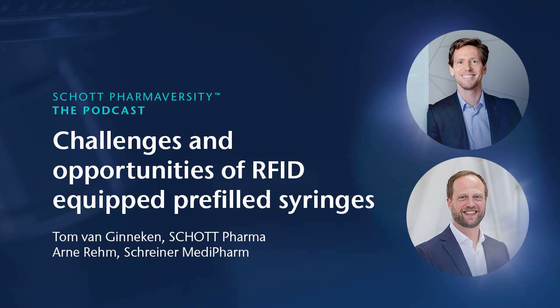There are several real benefits of using RFID compared to other unique identification technologies. There's no direct line of sight needed, which allows a very simple and especially fast reading process. Compared, for example, to visual identification technologies, this allows identification in bulk, meaning that a user doesn't need to scan something piece by piece, but just by being close enough to the tags, can read hundreds of pieces at once. So in a fraction of a second, you have the identities of hundreds of products in front of you. And because it has been used in so many industries and products for a long time now, the technology is really mature, and the cost structure is also pretty economical.